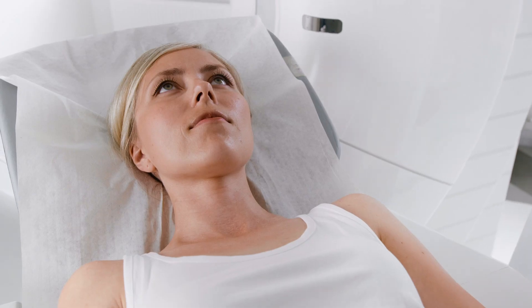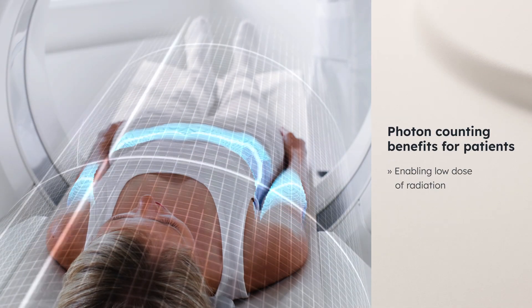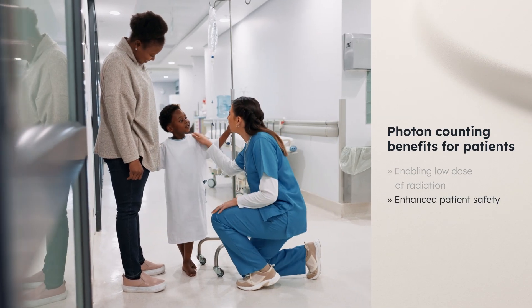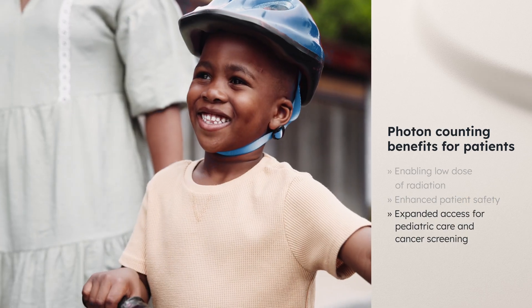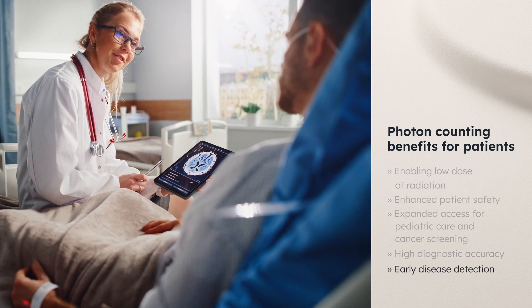Photon counting revolutionizes CT scanning and medical treatment by significantly reducing radiation dose, enhancing patient safety, making pediatric care and cancer screening more accessible, and ensuring precise diagnosis even in the early stages of diseases.